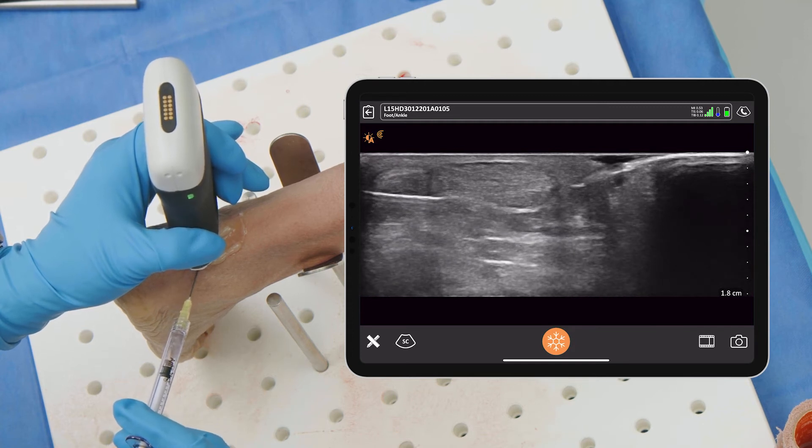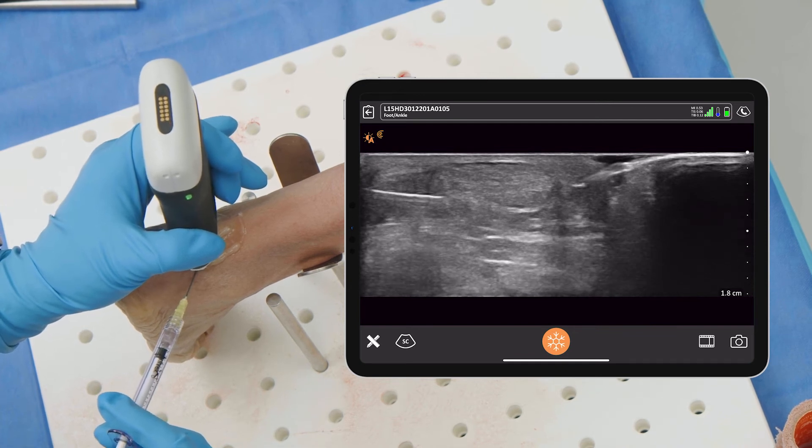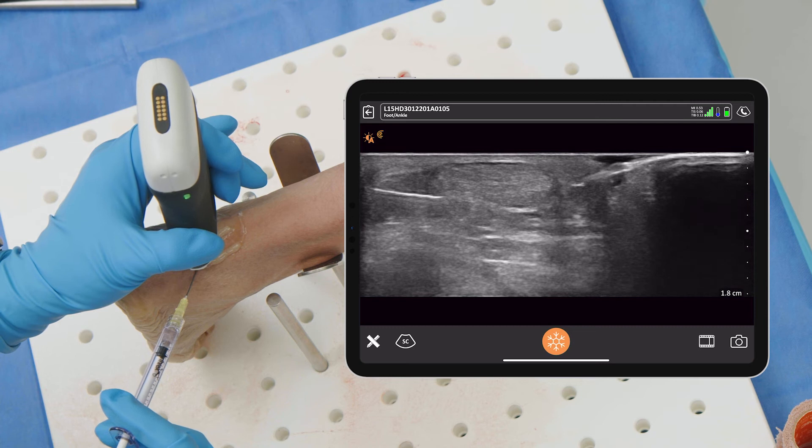You can see the fluid going in there. You can see that I'm in the right spot because it's flowing up and down — it's not creating a bubble. So we know that it's not in a fat area; it's definitely in the sheath itself and just flowing up and down.